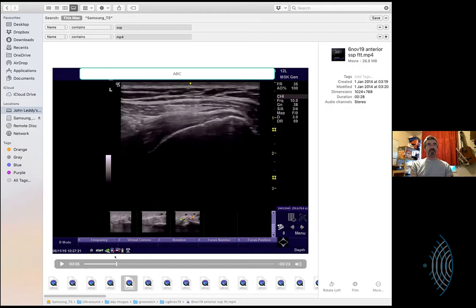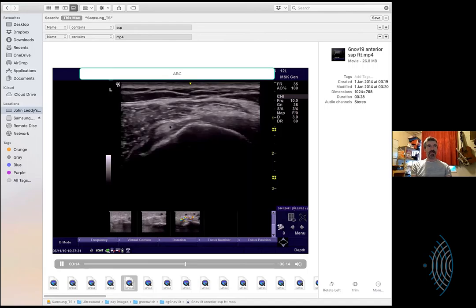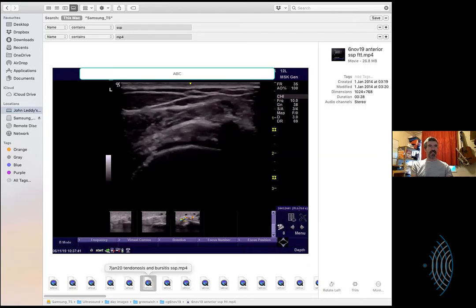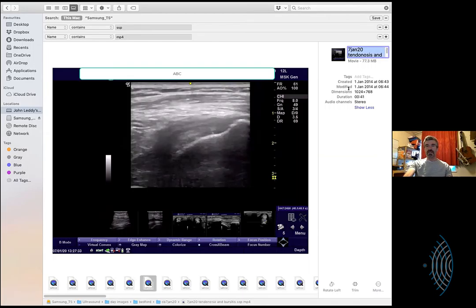Here, there isn't much to interrogate because you come up, you've got the biceps there, you're moving posteriorly, pointing towards the origin of the supraspinatus, and you're seeing some minor fibers. I don't know if I can freeze that there and bring it back a bit. You've got a little bit of something here, whether that's a little bit of retained capsule or whatever. I'm not sure. That would be my guess. Some of that ligamentous tissue, because the biceps looks pretty well seated. So you're still going to have bits of the coracohumeral ligament, and the superior parts of the capsule are still going to be intact around here. But I can't say I spend a lot of time looking at them. But I think that's quite a nice scan, or certainly the first part of it is.